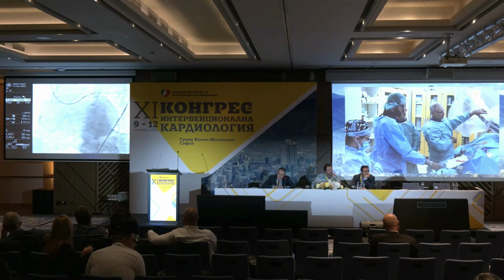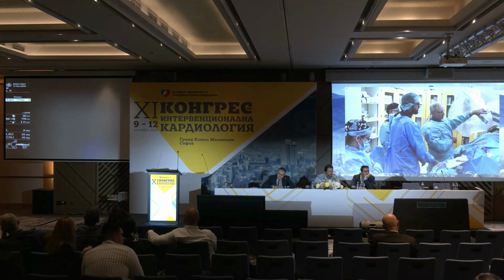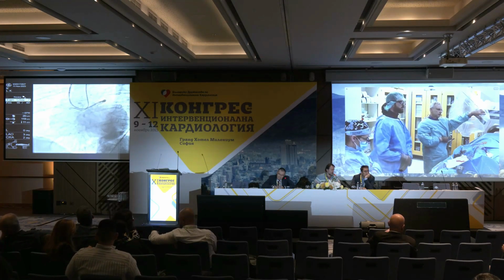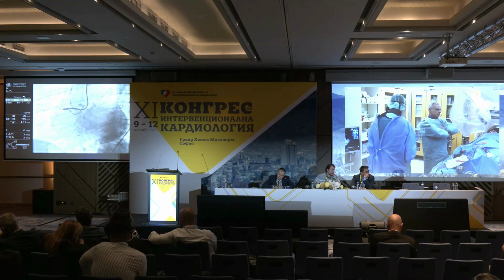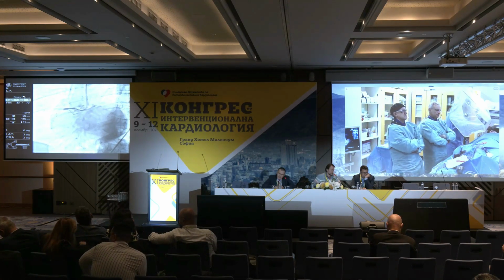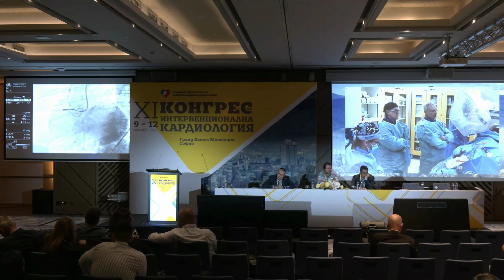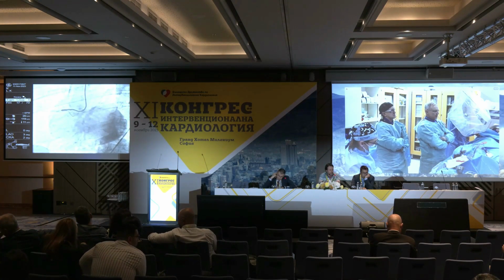Let me see a little bit where, when I did the puncturing, you see, it's exactly at this point where the antegrade wire goes out. Anyway, we'll do an echo now. If we see that there is pericardial effusion, then we will clearly understand that there is a communication.